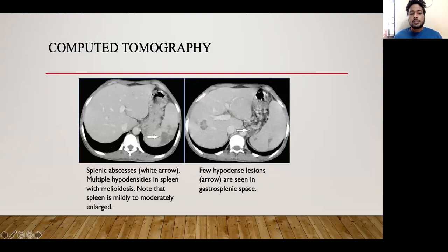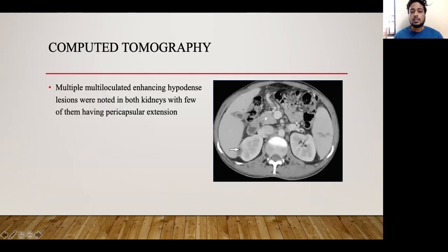Multiple hypodense lesions were noted in the spleen, consistent with splenic abscess in melioidosis. The spleen was mildly to moderately enlarged, and a few hypodense lesions were seen in the gastrosplenic space. Multiple multi-loculated enhancing hypodense lesions were also found in both kidneys, with a few showing pericapsular extension, as demonstrated in the images.